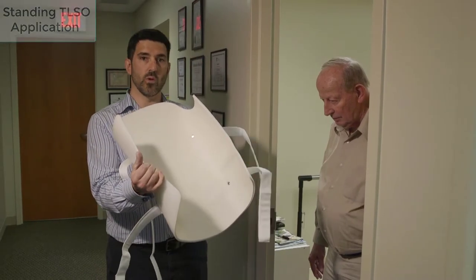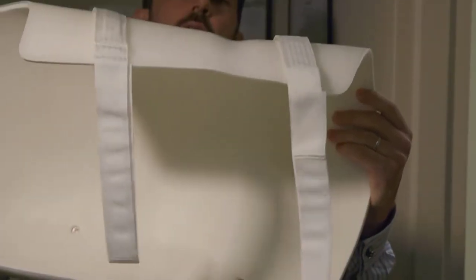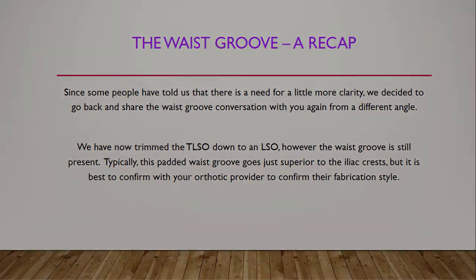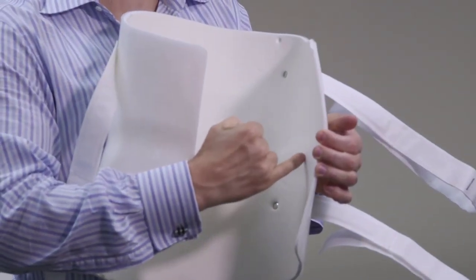If you can see it, there's a slight padded waist groove right there. And if you look closely at the brace itself, you can see there's a little indentation there as well. Hopefully you can focus in on this — this is the waist groove I'm talking about.